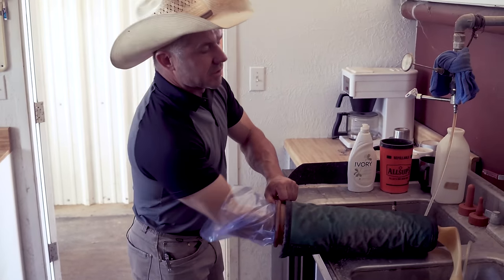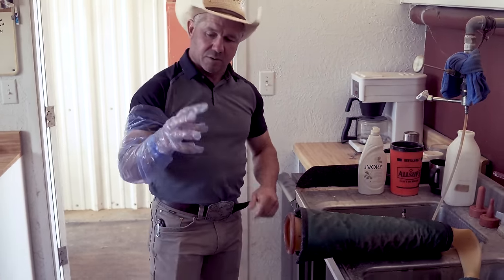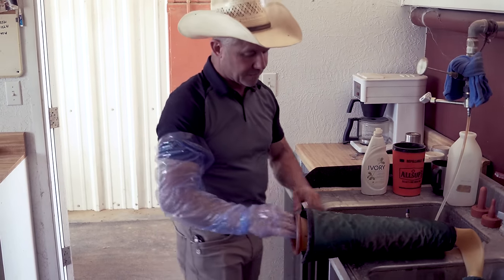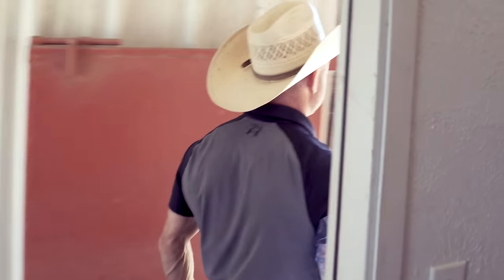I mean, every stud's a little different. I like these Missouri AVs, they work good. I want to be able to stick my arm in there and make a good fist, because right before they ejaculate, it flares out. And you don't want to hurt them by any means. All right, so let's come out here and we'll see what kind of wreck we get into.